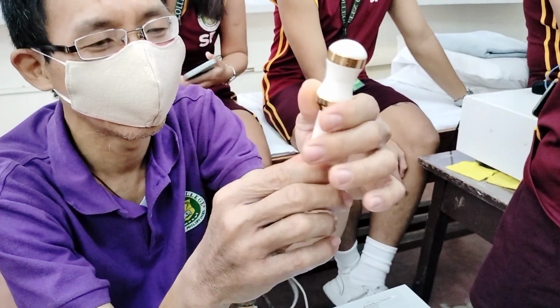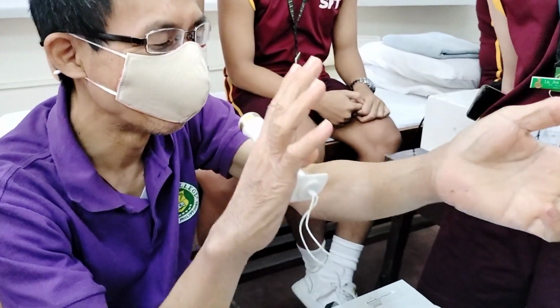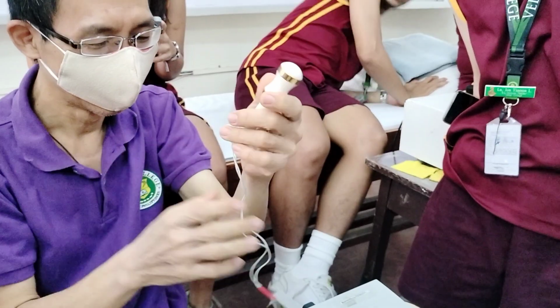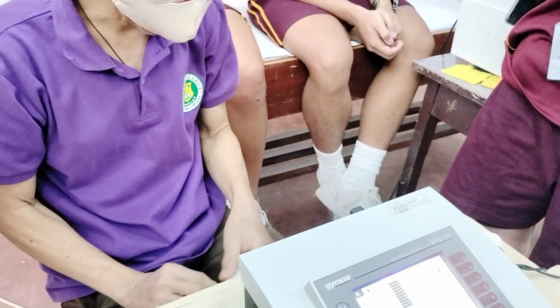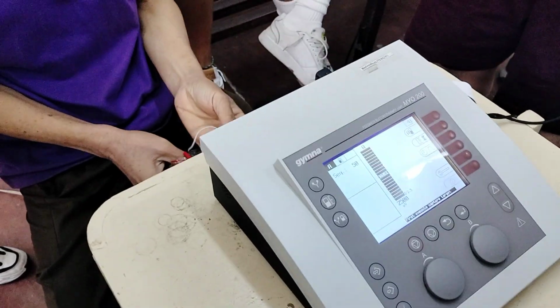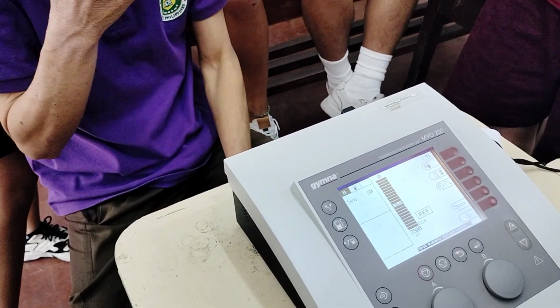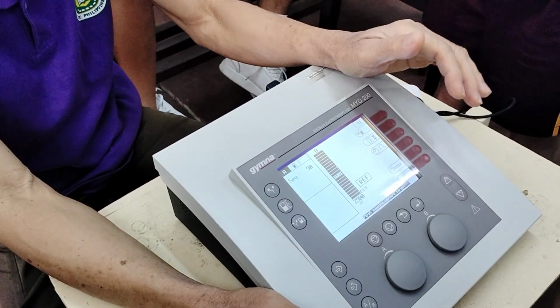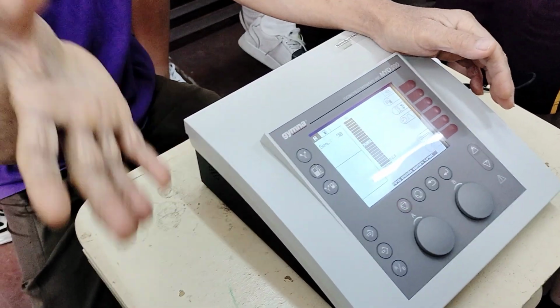Although we haven't tried demonstrating this because it's a sensitive body part. It's uncomfortable enough to demonstrate here, how much more if you display the anus. So at least you know it can be used for this type of rehab aspect. You can have proper draping: after inserting the device, you can cover it for privacy. Although usually it's a cubicle, so it's mostly just the therapist and the patient.